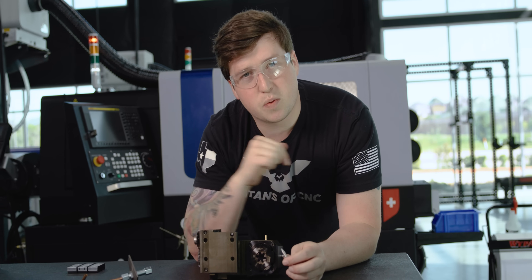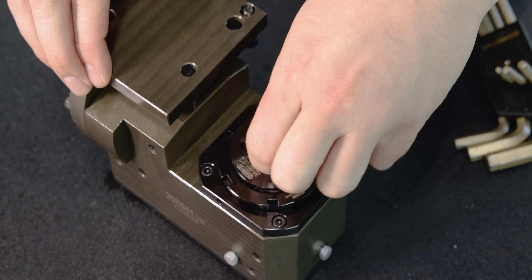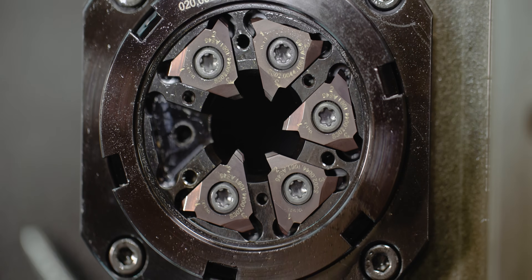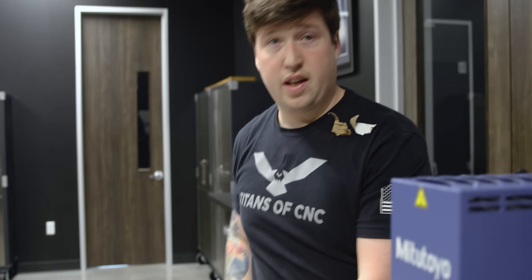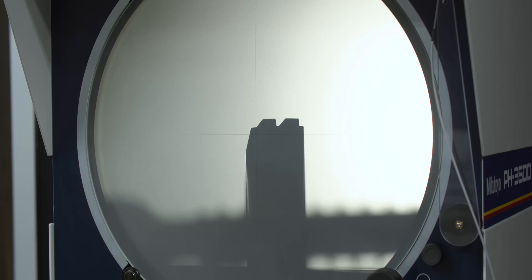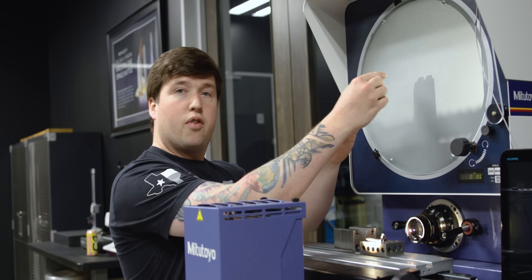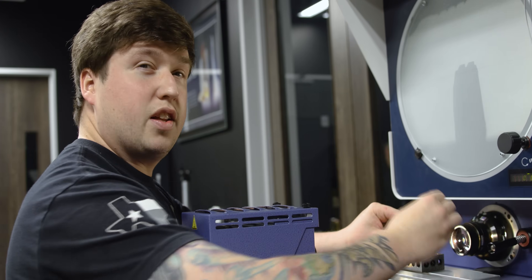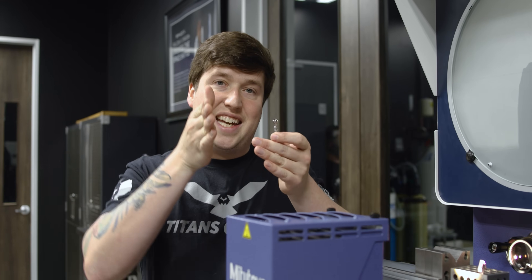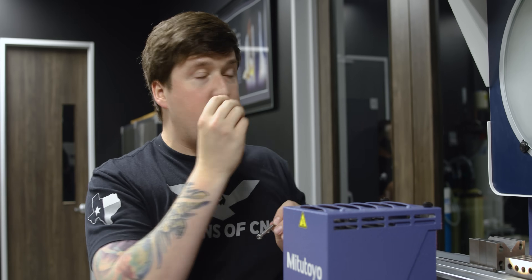Let's take this apart — I want to show you how it works. This is one of six custom inserts I took out of my thread whirling ring. Each one of these inserts has to be made specifically for whatever thread you're working on. So let's go into the quality office to see how it works. Now we're in the quality office. If you look at the shadow graph, I laid out one of the inserts — right here you can actually see the profile of the thread we're making. If I hold up a screw to it, you can see roughly how this is formed. The profile doesn't fit exactly because my thread whirler is kicked at an angle, running in line with the threads to make the form required.